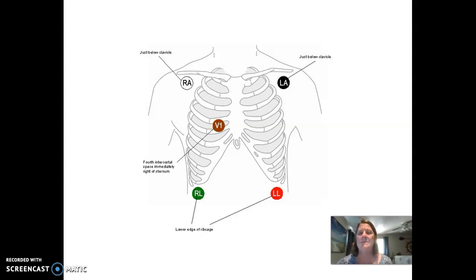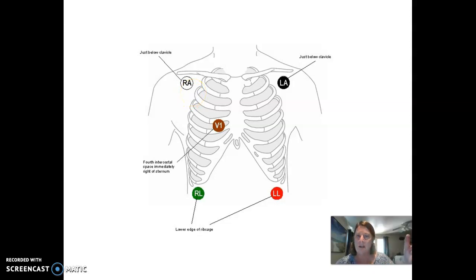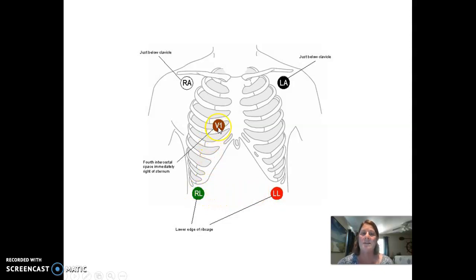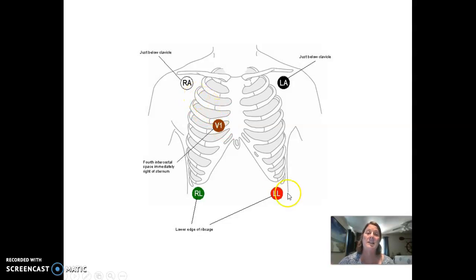With five-lead systems, you place leads the same way every time and just change which direction you want the monitor to read on the screen. White RA goes towards the right arm, black goes towards the left arm, red goes towards the left leg, green goes towards the right leg, and the brown one — V1 — goes in the fourth intercostal space to the right of the sternal border. Then you change the vector from the machine, whether you want it to read lead two or MCL, and it changes the direction vector it's reading.